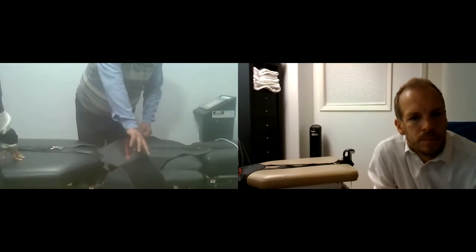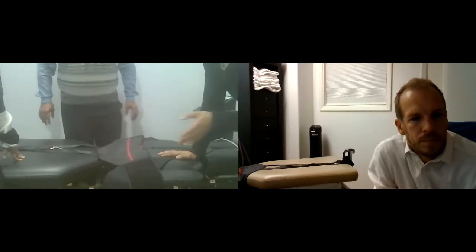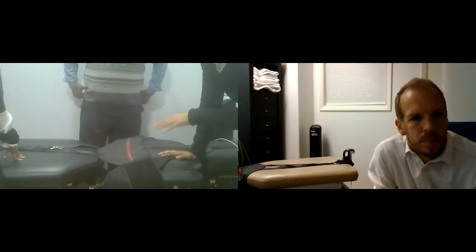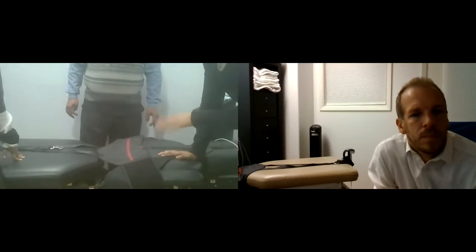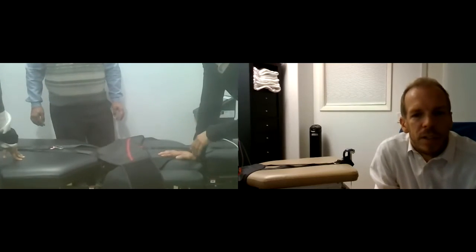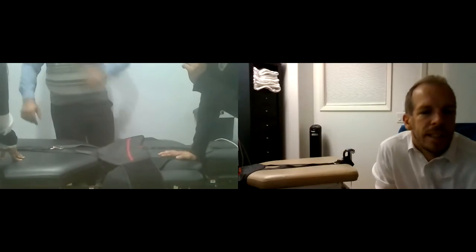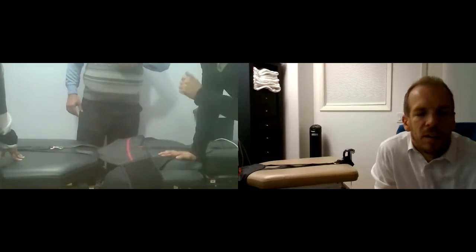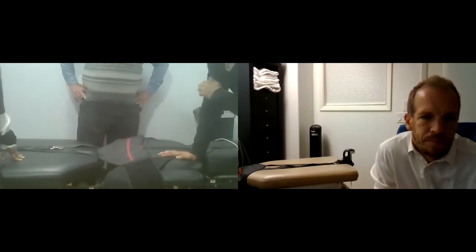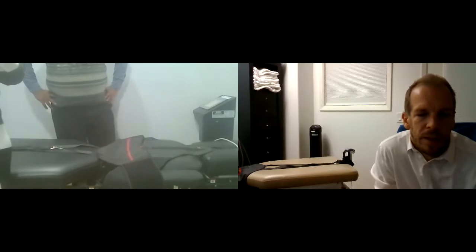One question. Do we have to rotate or laterally flex this table while the patient is on the table, or first we adjust the table position and then we take the patient on the table? Great question. Put them on the table first, and then put their harnesses on, and then the last thing you would do is put them in the lateral flexion and rotation. I'll show you that now as well.